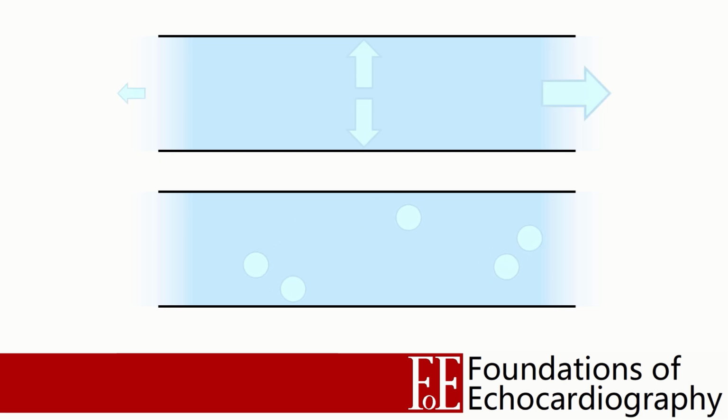Now let's imagine that our liquid is in a pipe and is flowing from left to right. Now the motion of the particles is no longer equally random in every direction. There does remain some movement in every direction, but on the whole there is more movement in the direction of the flow than in other directions. And so we see fewer collisions with the walls of our pipe. As the number of collisions with the wall decreases, this equates to a decrease in the pressure within the pipe. The faster the liquid flows, the more likely individual particles will be moving in the direction of the flow, the less likely they will collide with the internal surface of a pipe, and the lower the pressure.